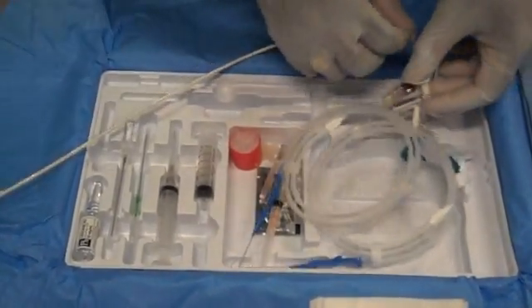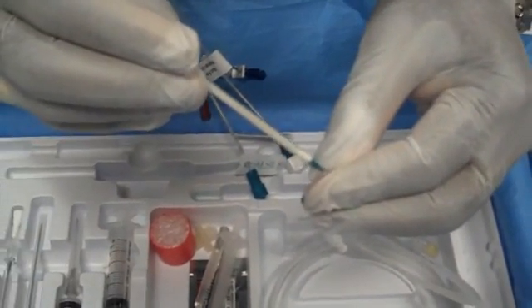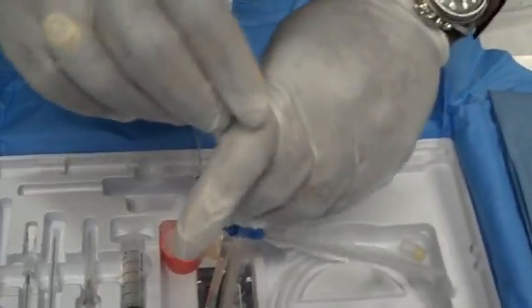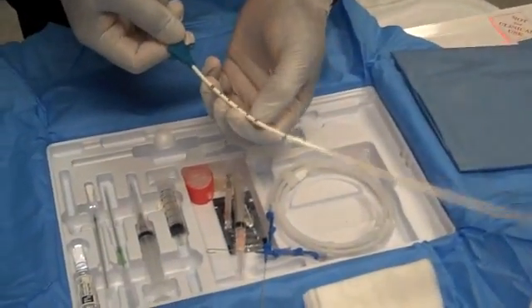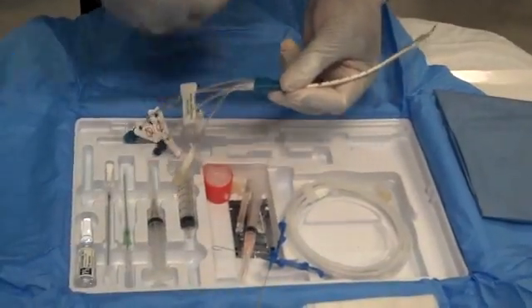Remove the cap over the distal port and thread the guide wire through the distal port, advancing it down past 30 centimeters. Then you would suture it into the skin as you would any normal triple lumen.